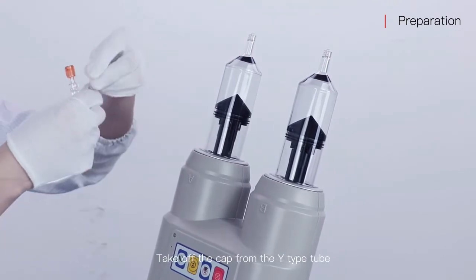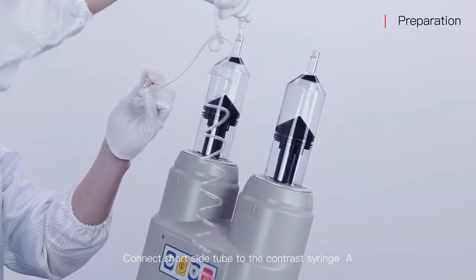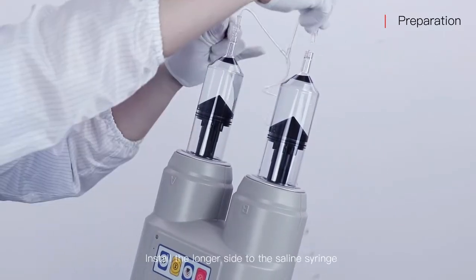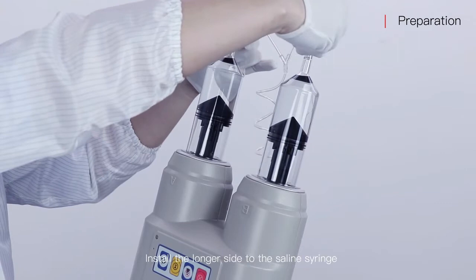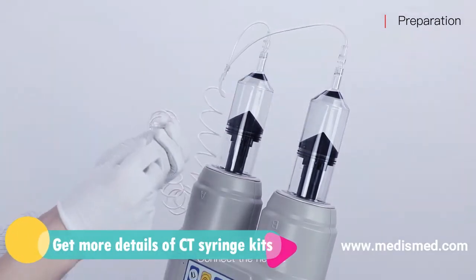Take off the cap from the Y type tube. Connect the short side tube to contrast syringe A. Install the longer side to the saline syringe. Connect the needle.